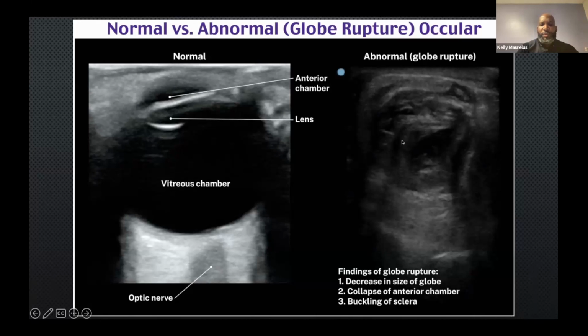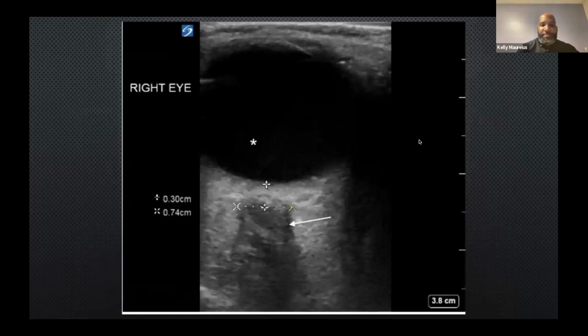All right. So obviously in patients who have trauma, this is controversial because you don't want to put so much pressure on the eye. However, in some cases where the eyelid is very close and therefore you can't visualize the eye itself, sometimes placing lots of gel, less pressure on the eye itself by placing your fingers on the nose bridge, you can visualize the eye through the lids, and you can see this, and this will give you a hint of whether to get ophtho immediately versus waiting for a CAT scan. And in this case, you would get ophtho immediately.